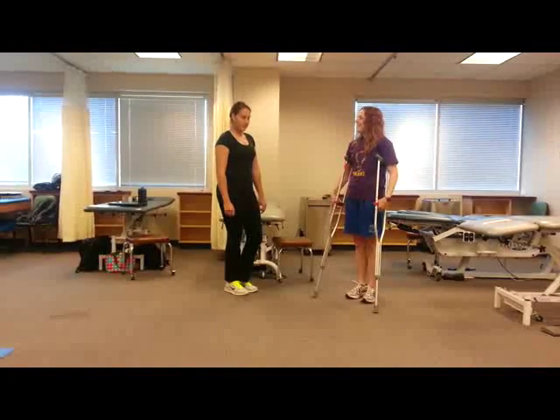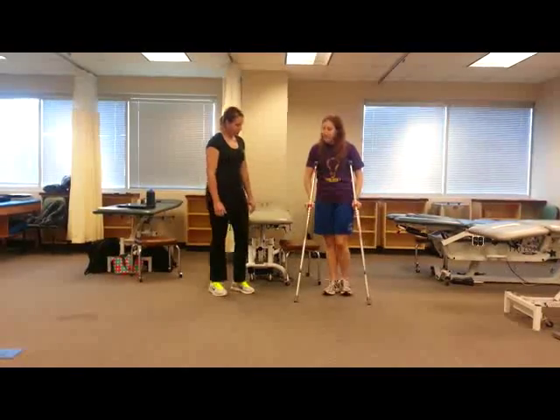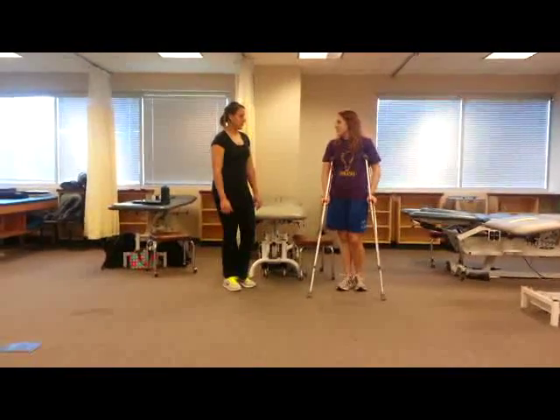Any questions so far? Good. So that's it for adjusting the crutches. Once we have the patient up, there are a few different gait patterns we can use with them.